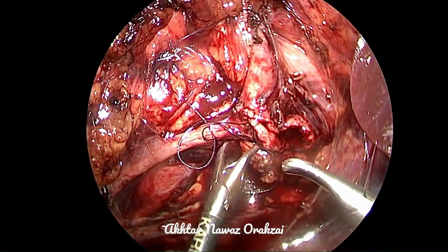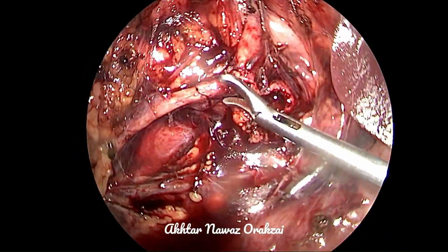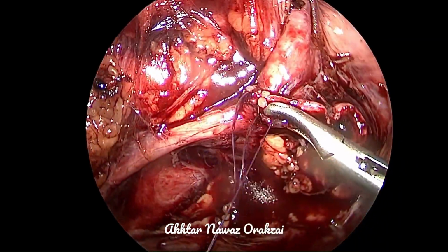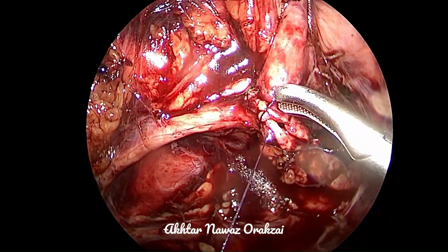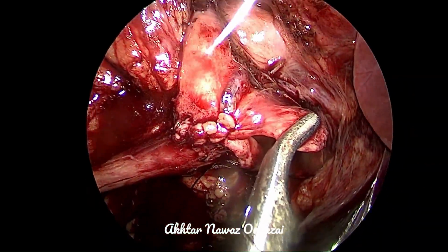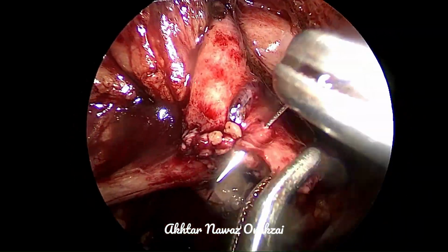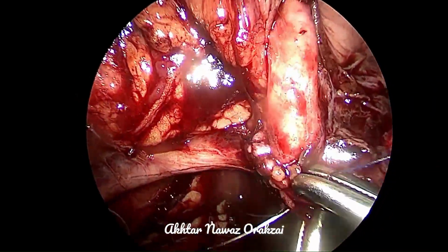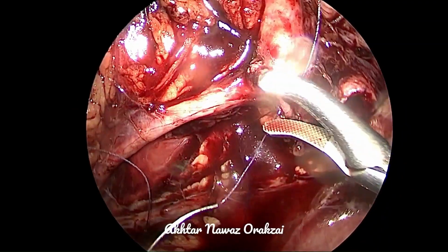So when the compressing vessels are encountered, literature says that in 60 to 70% of the cases there is no intrinsic factor or adynamic segment. The only pathology is the crossing vessel.